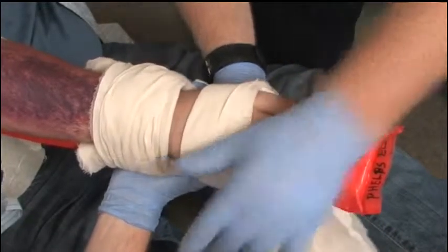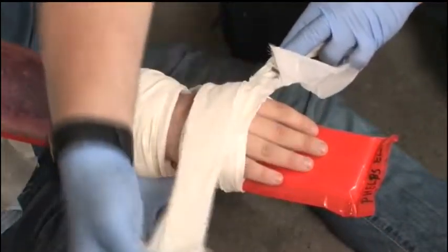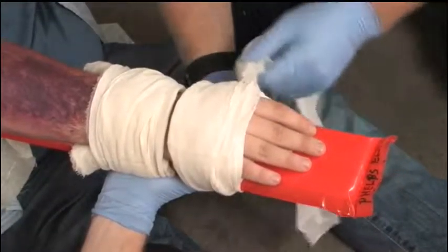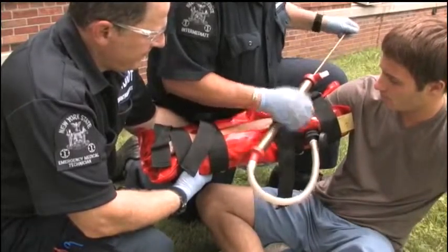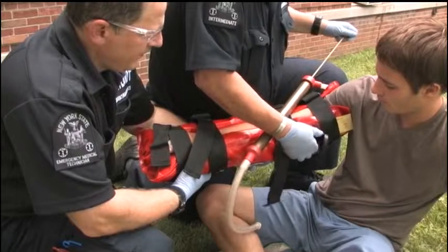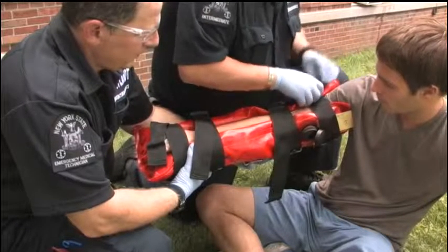Secure the splint in place with cravats, cling, tape, or other fasteners. The device should be secure enough to prevent movement, but not constrict distal circulation. If using a vacuum or air splint, secure the splint, then adjust the air pressure. You may need to slightly adjust the straps once the pressure is adjusted.